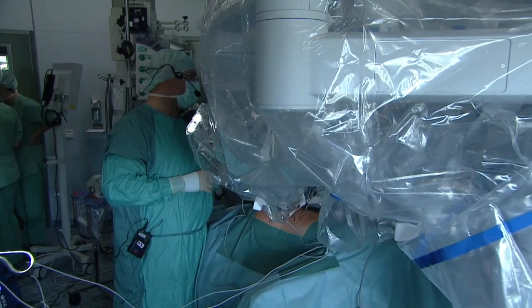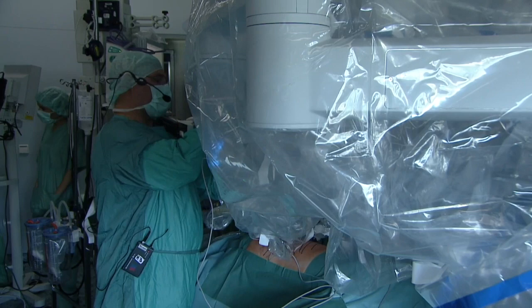You're going to start 30 up, 30 down? Zero the whole case. Hot. Yeah, zero scope. It keeps it off the hip.